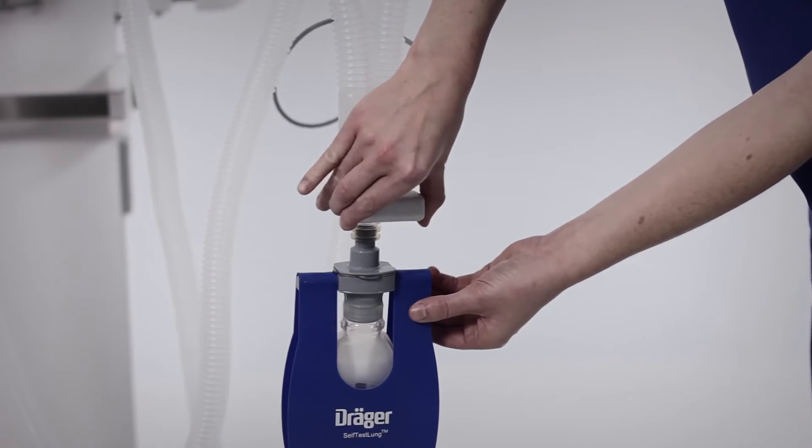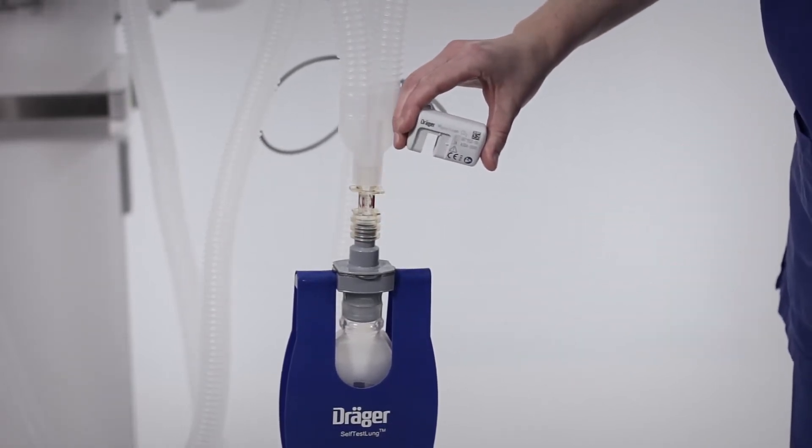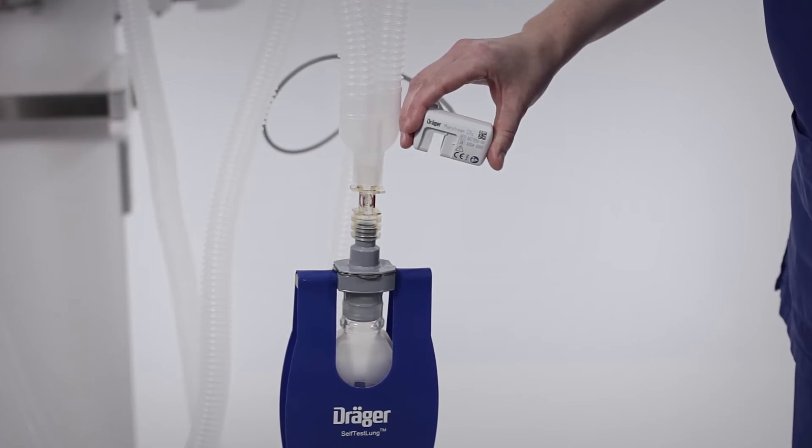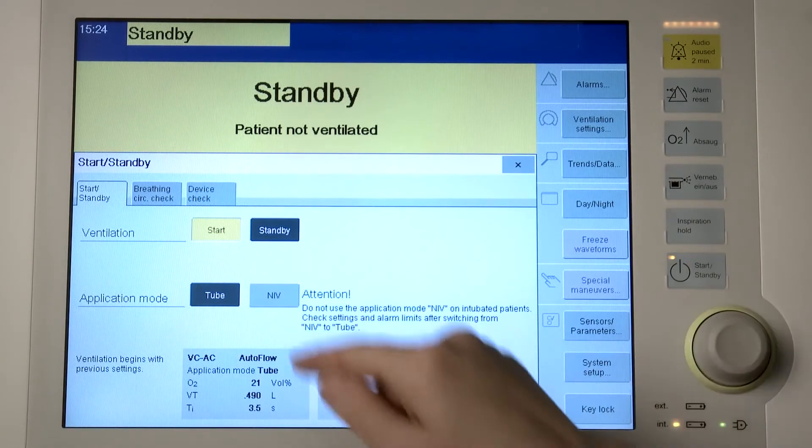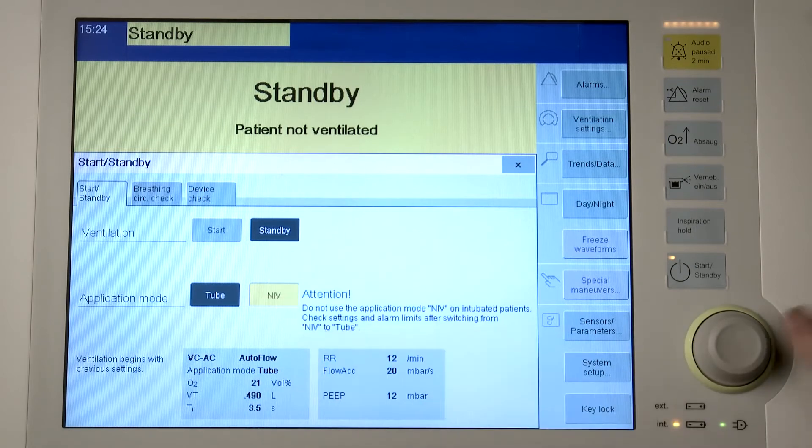Remove the CO2 sensor from the cuvette and hold in ambient air. Do not breathe on or into the cuvette. Savina 300 can be used for the ventilation of intubated patients in application mode tube and for non-invasive ventilation in application mode NIV. Open the start standby page while Savina 300 is in standby mode and touch the tube or NIV button. Confirm with the rotary knob.